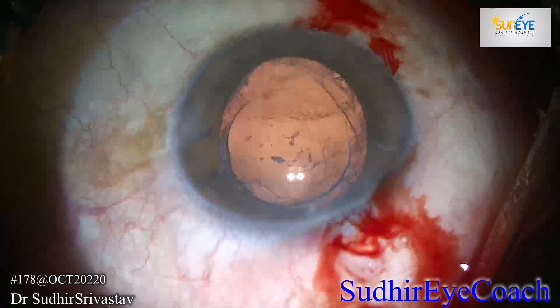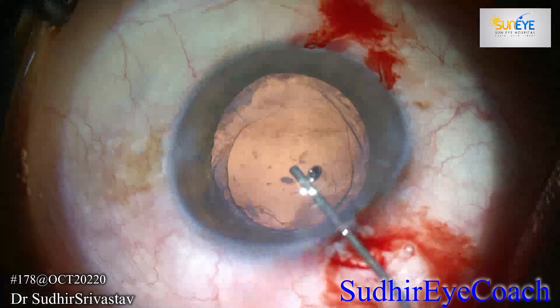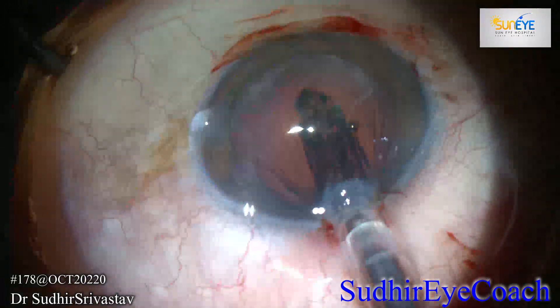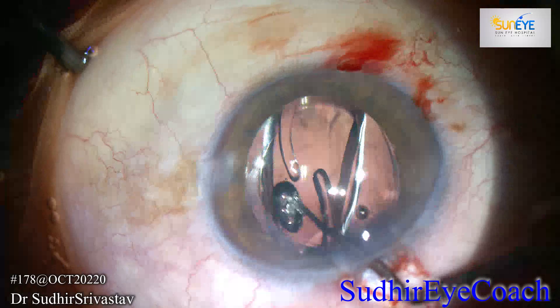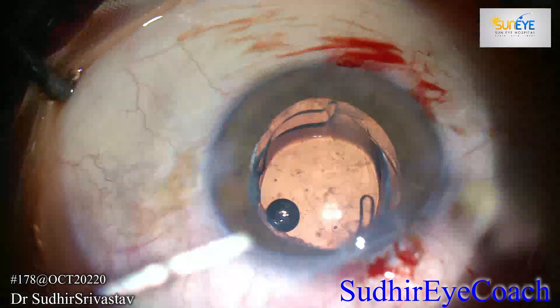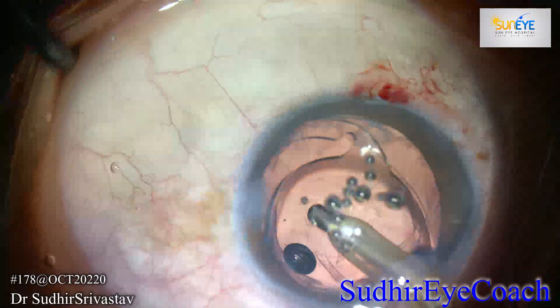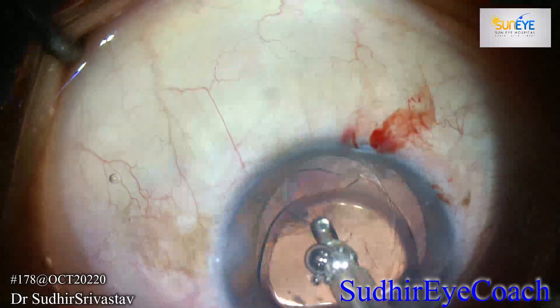I decided to go for IOL implantation because the intraocular lens will also support the capsule and will stretch the area of subluxation. I decided to go with the regular single-piece hydrophobic implant in the bag, and placed the IOL in such a way that the optic-haptic junction remains in the area of subluxation, because this is the larger diameter and it will secure your capsular support.